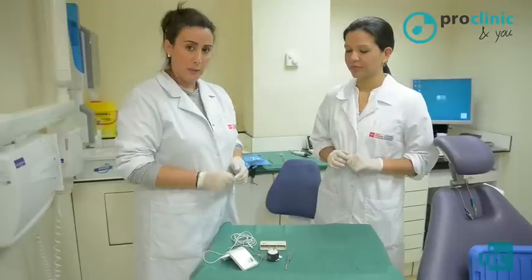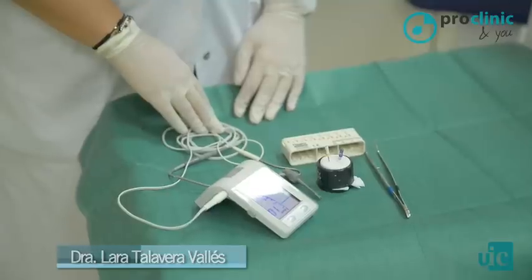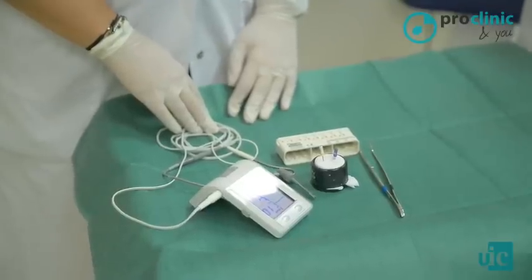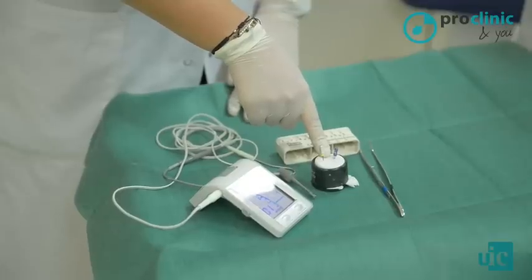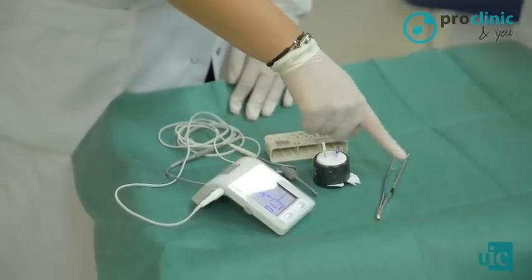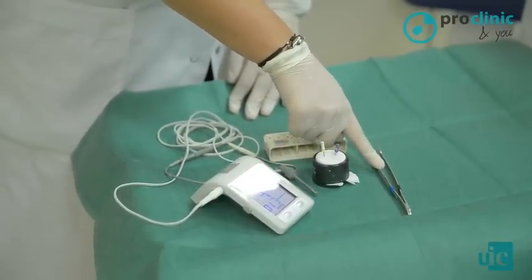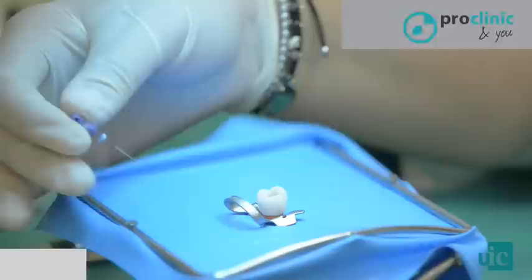Once we have drilled into the pulp chamber, the first step is to locate and to determine the working length of the root canals. We need small gauge files, for example, K files of number 10 or 15, an apex locator, tweezers to set the rubber stop at a reference point, and a little ruler to determine the length.